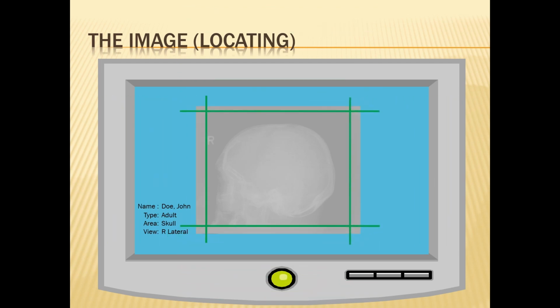The first step in correction is finding the pixels that contain relevant image data. For the lateral skull, the adult skull can be easily contained in a landscape-oriented 10 by 12 inch radiation field. The computer searches the data coming from the capture media for collimation borders. Pixels inside the border are used to implement correction. Pixels outside the border are ignored. Poorly collimated images will display inferior results.